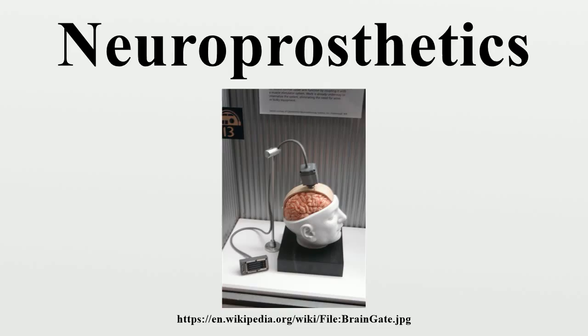From 1969 onwards, Brindley developed the Sacral Anterior Root Stimulator, with successful human trials from the early 1980s onwards. This device is implanted over the sacral anterior root ganglia of the spinal cord, controlled by an external transmitter. It delivers intermittent stimulation which improves bladder emptying. It also assists in defecation and enables male patients to have a sustained full erection. The related procedure of sacral nerve stimulation is for the control of incontinence in able-bodied patients.